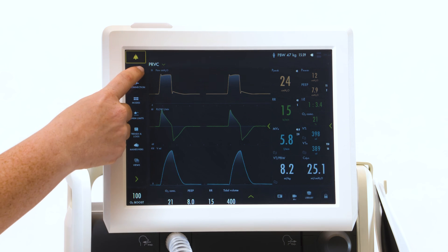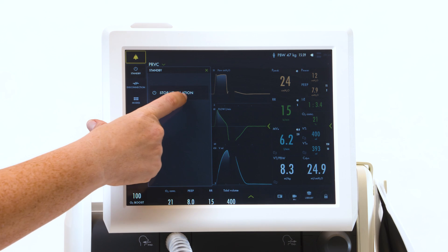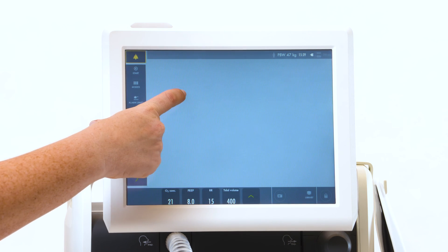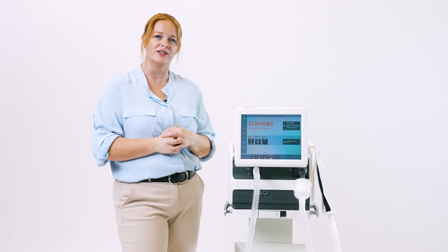To stop ventilation and go into standby, touch standby and then touch and hold stop ventilation till the blue bar goes across. Now you can switch into non-invasive ventilation if you would like.